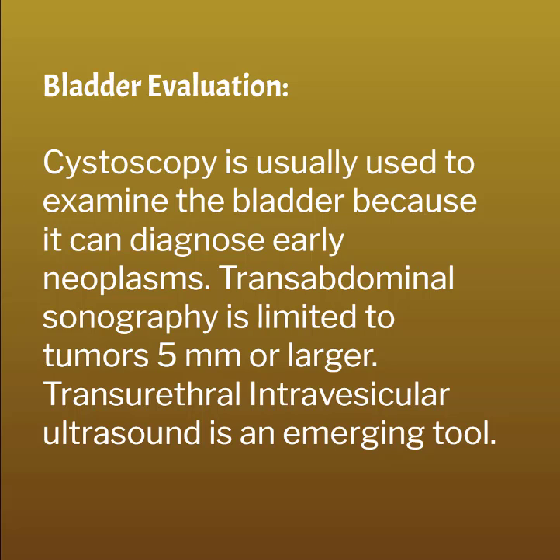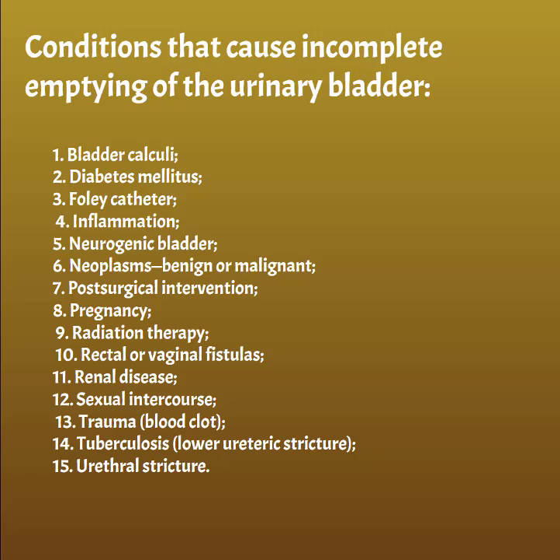Ultrasound can be useful for detecting large stones, for evaluating the walls, for looking for debris or other abnormalities of the bladder. Now, there are tons of reasons why somebody's bladder might not empty. And urinary retention is one of the bigger reasons why we get ultrasound orders. People feel like they can't get it all out, or they feel like they're going way more often than they should. And so some of those things that cause incomplete emptying of the bladder include bladder calculi.